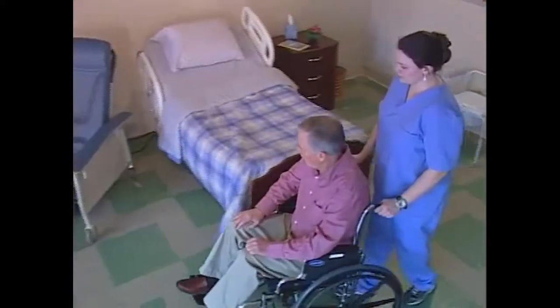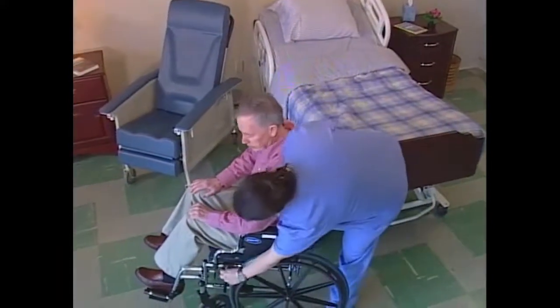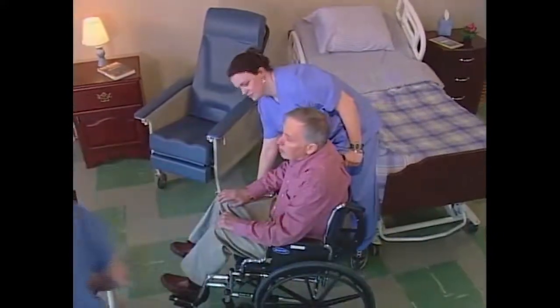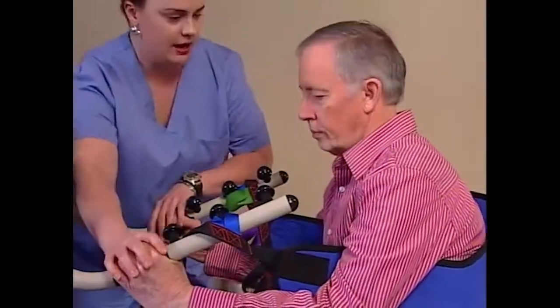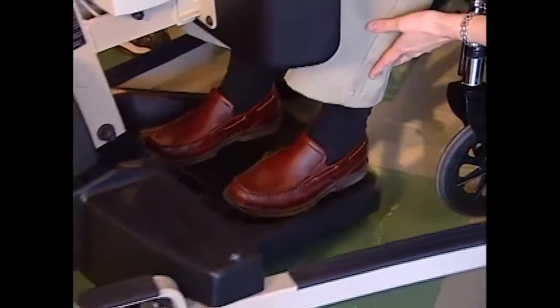Before you attempt any kind of lift, make sure that you understand the resident's limitations and their ability to assist with the transfer. It's a good idea to communicate with the resident throughout the process. Let them know about each step before you perform it so that the resident is comfortable and relaxed.